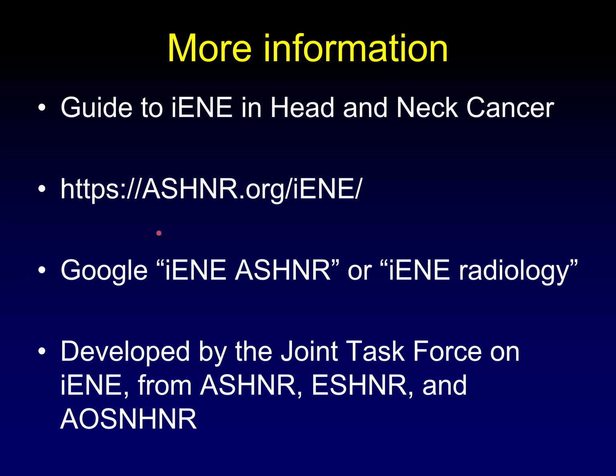There are many more examples than the ones that I've shown here, some of the ones I showed, but many more examples available on the website to help guide you in better understanding this hugely important concept. All of this was developed by an international joint task force on iENE that is composed of members from the American Society of Head and Neck Radiology, the European Society of Head and Neck Radiology, and the Asian-Oceanic Society for Neuroradiology and Head and Neck Radiology, all working together to produce this.